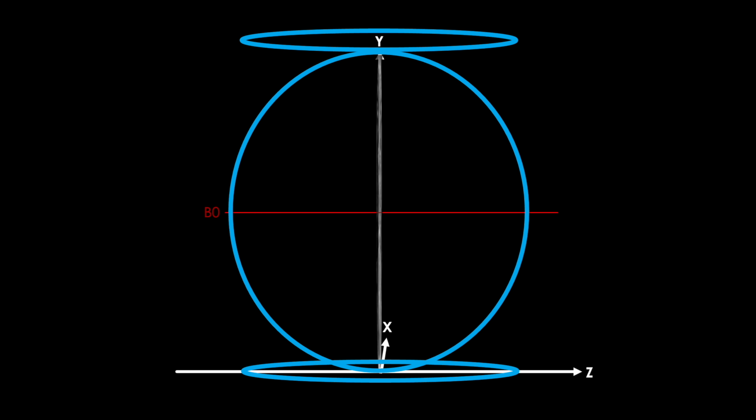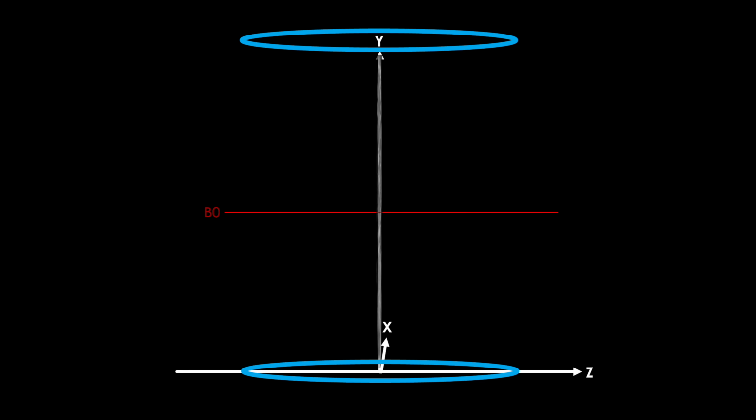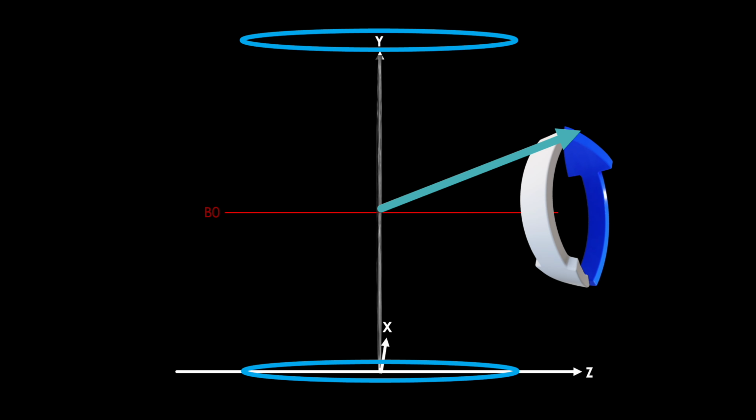In this view, looking directly at the side of our slice, we see our receiver coils paralleling the z-axis. Let's hide this set right in front of us just for visualization purposes. And let's drop all notion of phasing and rephasing for a second and just focus on our net magnetization coming from the entire slice and precessing after applying our RF pulse. How does it look to our receiver coil from this point of view? If we draw the path of rotation this vector makes, we get something like this.